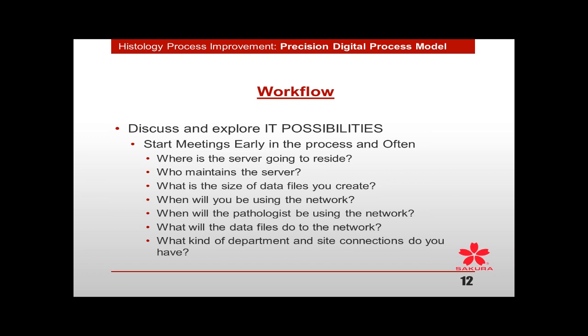When will the pathologist be using the network? A lot of times you can go and talk with your IT and they'll tell you that we have this capability and capacity in the network. Well, that's at 11 o'clock at night till 6 o'clock in the morning. Now we're talking about from 8 o'clock in the morning till 5 o'clock in the afternoon when everybody in the system wants to use the network. Well, you've got a pace less than dial-up. No one's going to be happy.